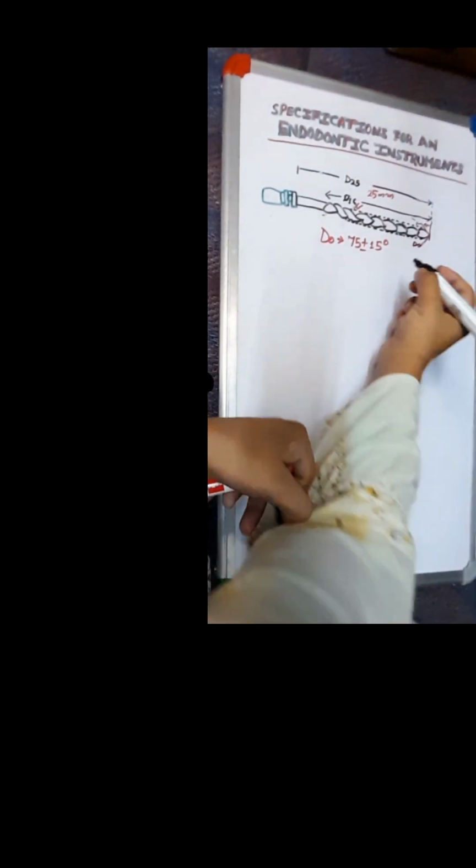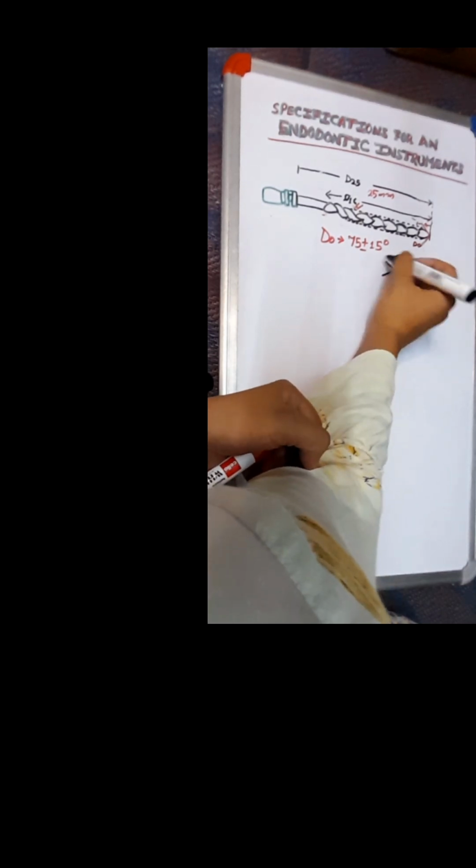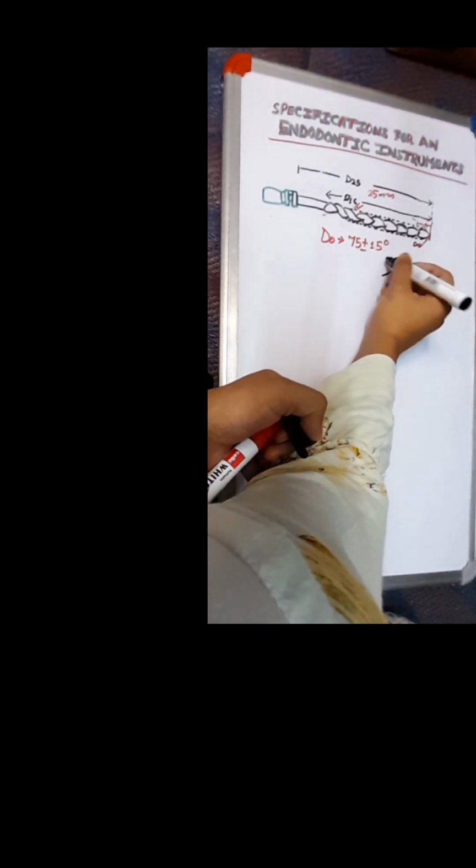Now with the increase in taper, the diameter of the instrument would increase with each millimeter of increase in length of the instrument.